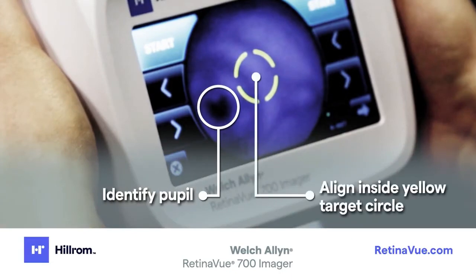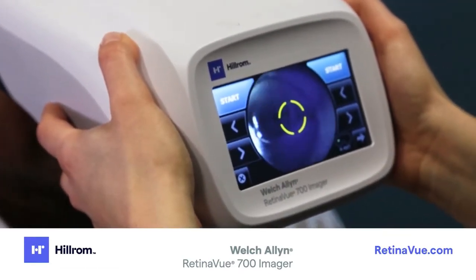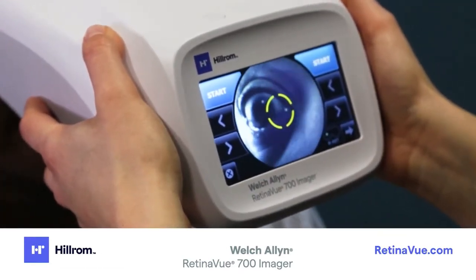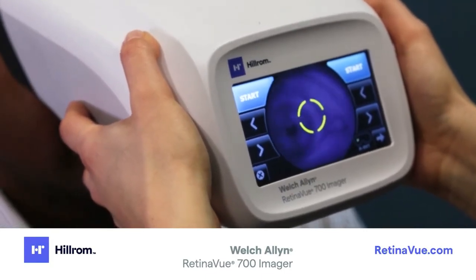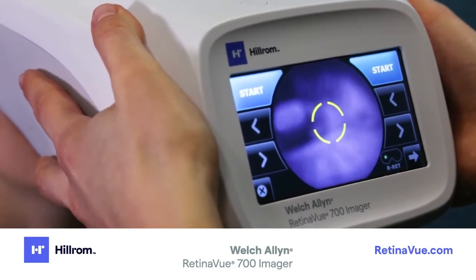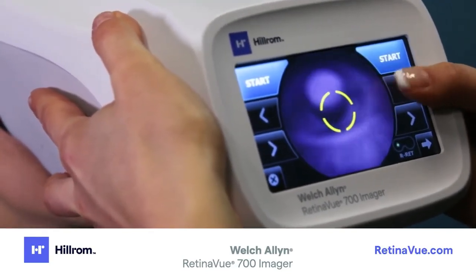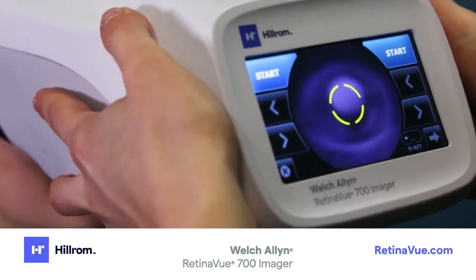If the pupil is located above or below the yellow circle, pull the imager slightly away from the patient and realign the pupil to the yellow circle. If the yellow circle is located to the left or right of the pupil, touch the left or right arrows to align the yellow circle to the pupil.